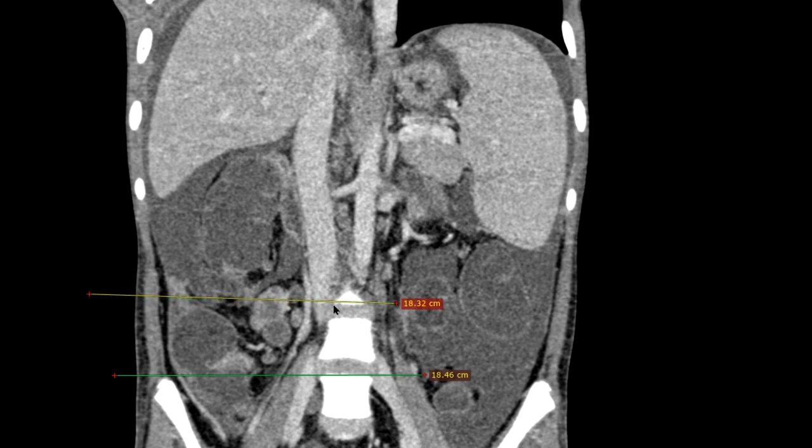Suppose if it lies very much above the iliac crest level, then it is said to be a pulled up ileocaecal junction, and in that case even the angulation of the ileocaecal junction will change, and the terminal ileum will show a hanging kind of appearance, like a goose neck kind of deformity. All those signs need to be mentioned in a patient suffering from ileocaecal tuberculosis.